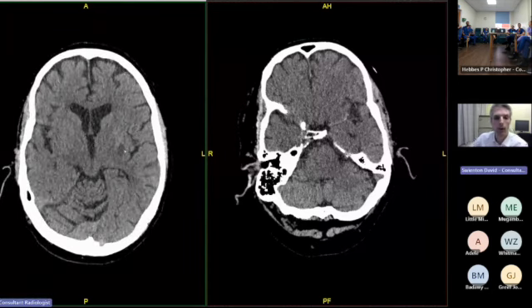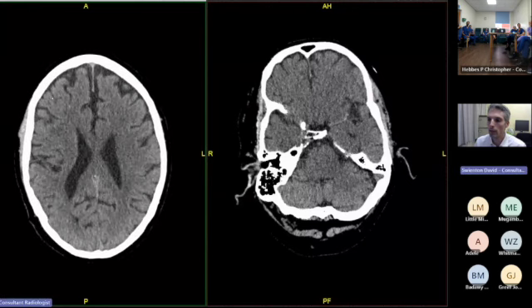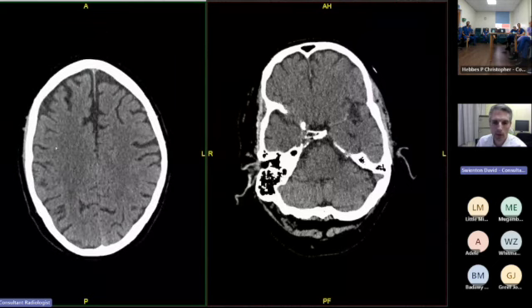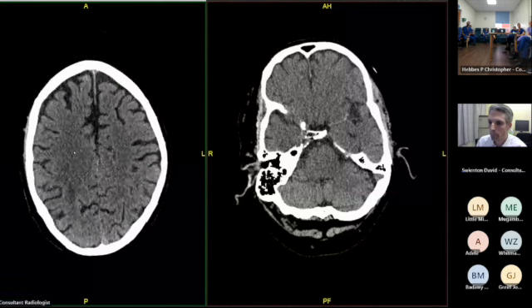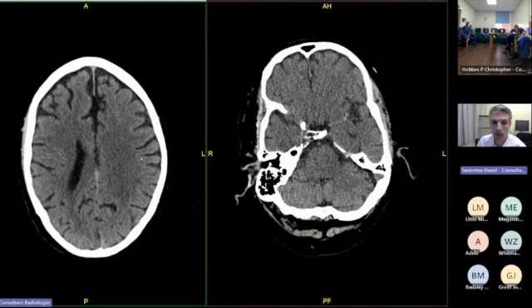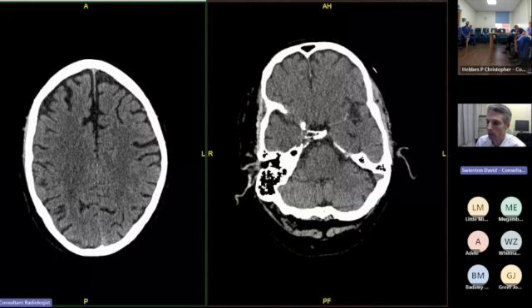Water goes into the cells, and that evens out the normal status of things, where the grey matter is slightly brighter than the white matter, because the white matter is full of myelin, which is fat, which is very low attenuation on CT. If you look at the fat in the scalp, it's very low attenuation. So that's why the white matter is a bit darker than the grey matter on CT. It's a bit fattier. But once those cells have died, the water starts going in, the attenuation of both goes down, and they tend to even out. So that's what loss of grey-white matter differentiation is.